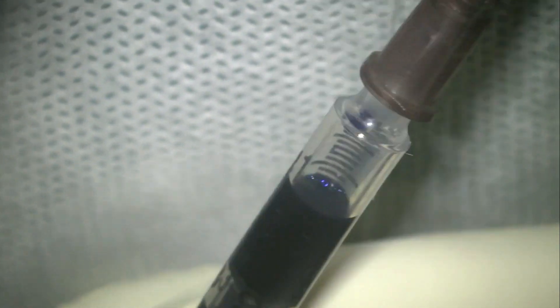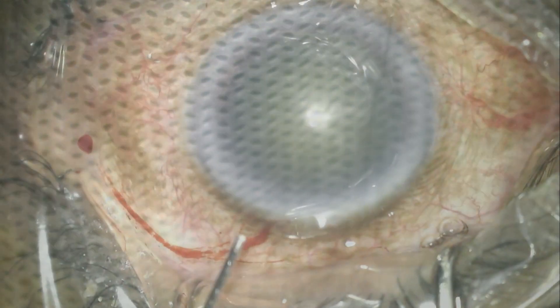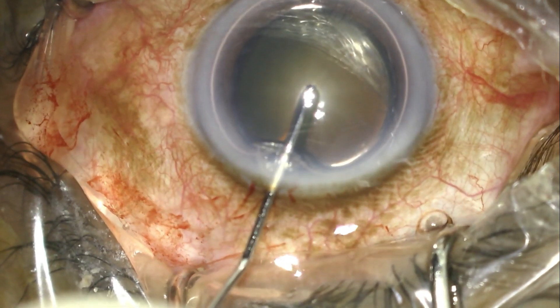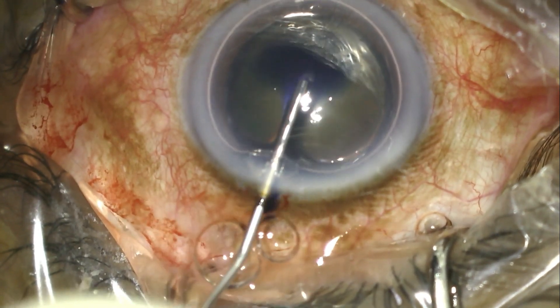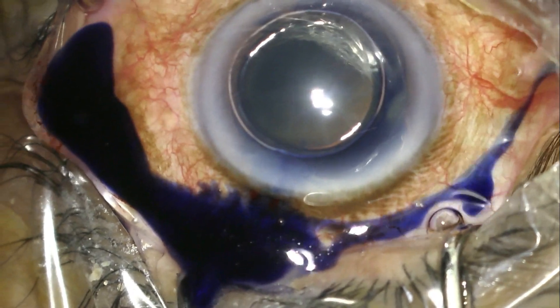Please note that despite turning the syringe downwards, air still remains in the anterior part of the syringe. The surgeon introduces the cannula and starts to slowly inject. The first thing that comes out is the air, and under that bubble of air the surgeon drops a few drops of blue dye onto the anterior capsule.